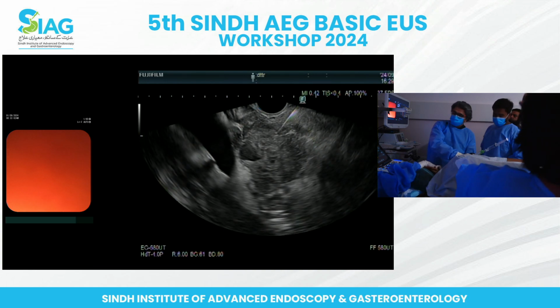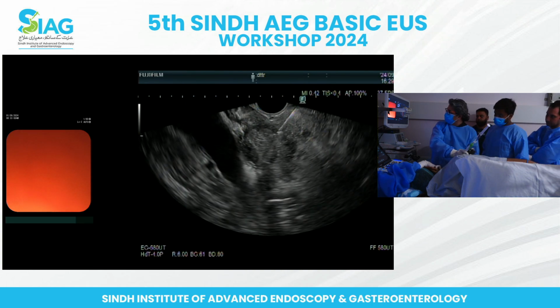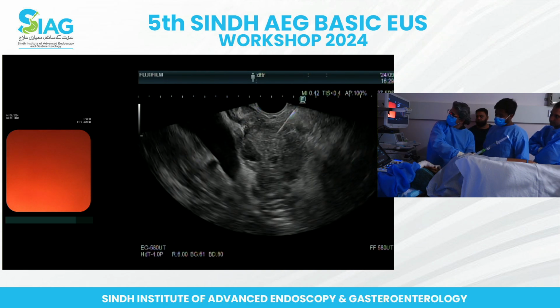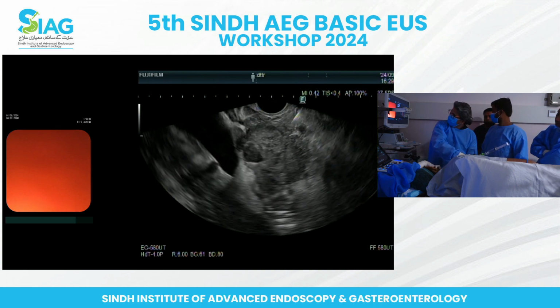So he's trying to change the track of every other pass. You may not appreciate that, but with the wheels and sometimes with the elevator, he's trying to change the track after every 2-3 back and forth movements.